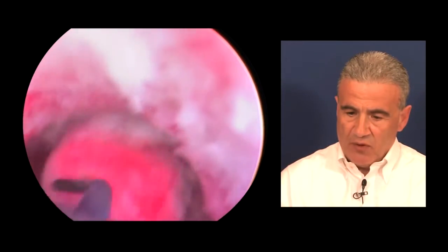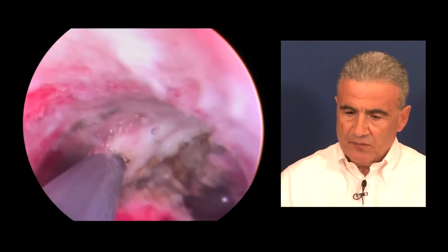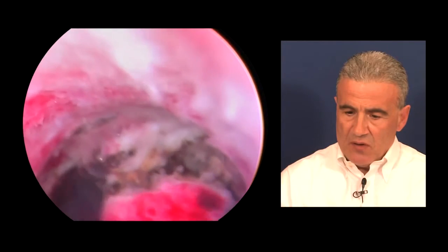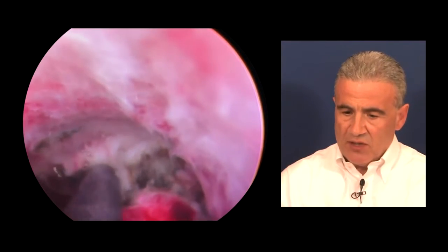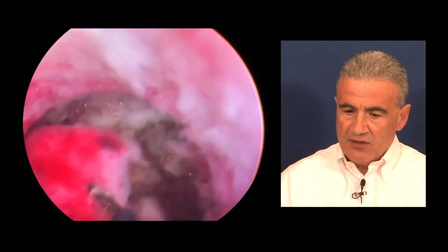We observe that the polyp has been almost completely detached. We observe a small residual fibrous area in the insertion area.